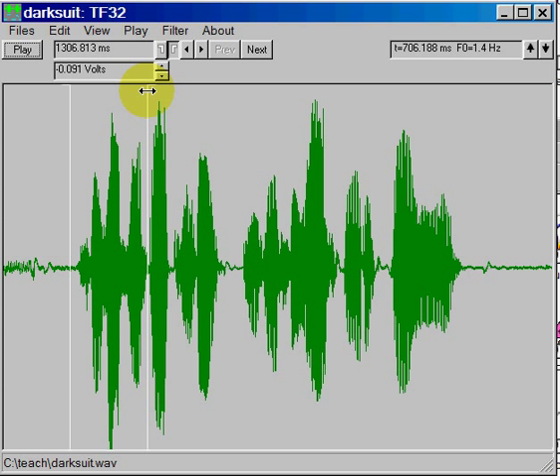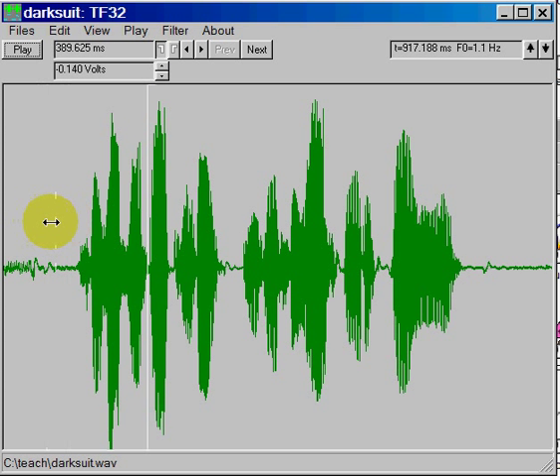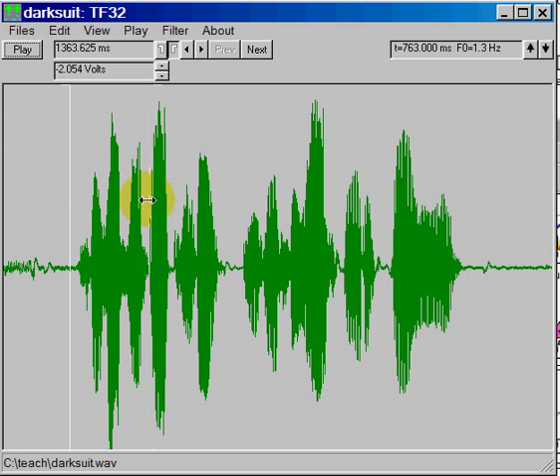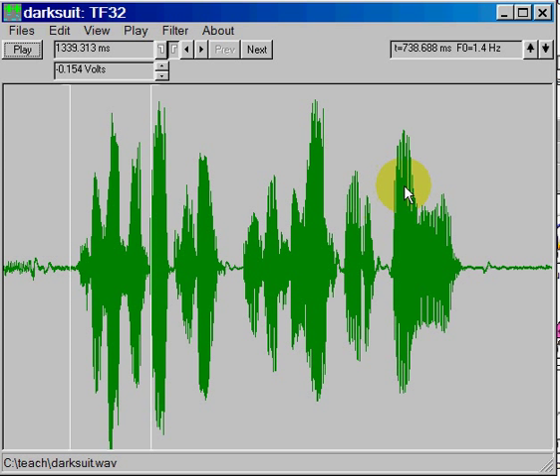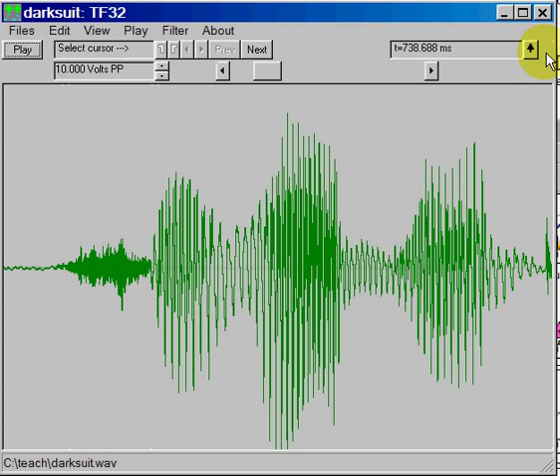Now we can use the left and right cursors, and you can click and drag those cursors to find a portion of the speech sample that we want to look at in more detail. Once we have captured a region of interest, we can then take our mouse up to the upper right, and if you click on the down arrow, it will time expand so that you can zoom in around that region of interest.